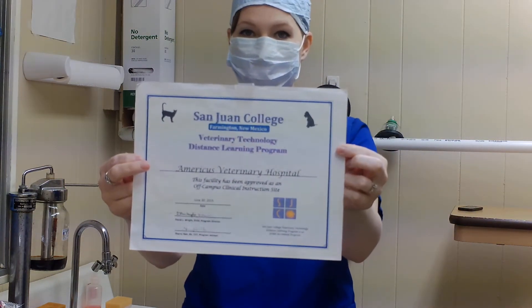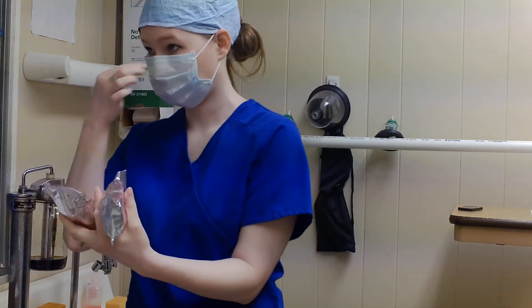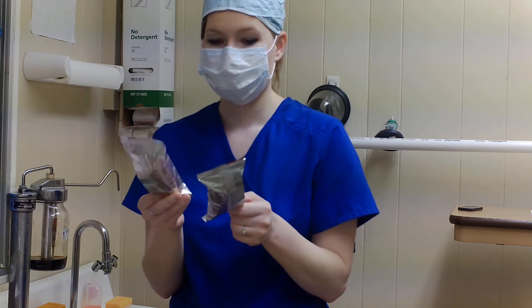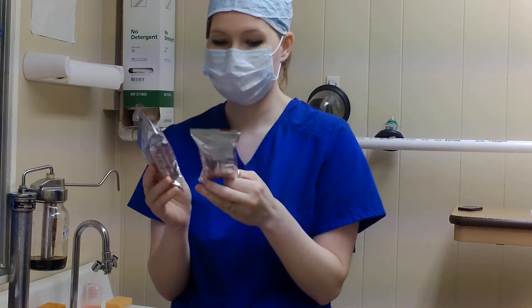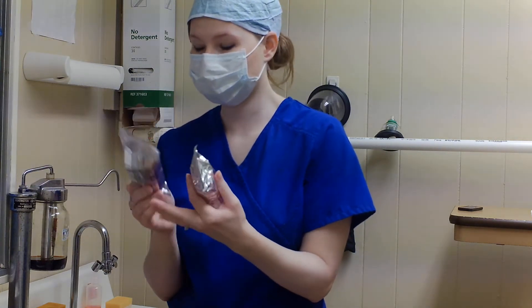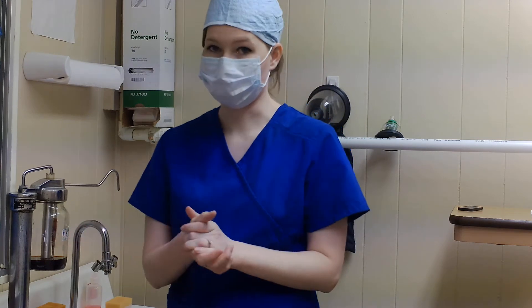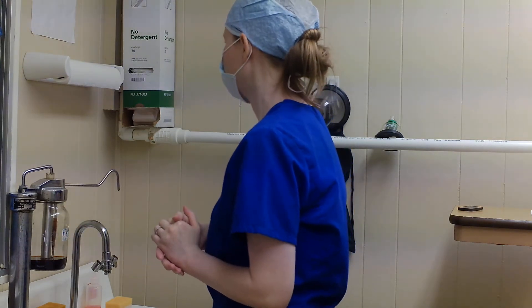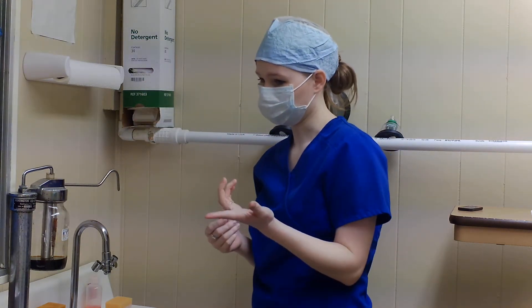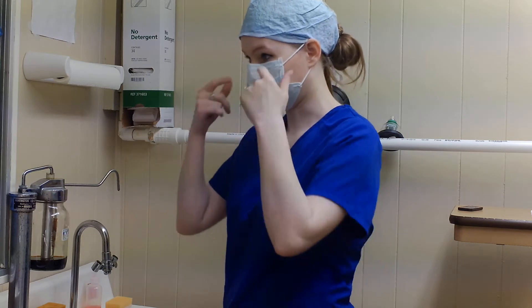So this is my OCCI certificate. What I've got is two sponges that have chlorhexidine — 4% chlorhexidine. That's just what our office uses. We do have some that contain povidone-iodine, and we also have some that have no detergent. But I'm going to use the chlorhexidine. I also have some betadines available if I need any more.